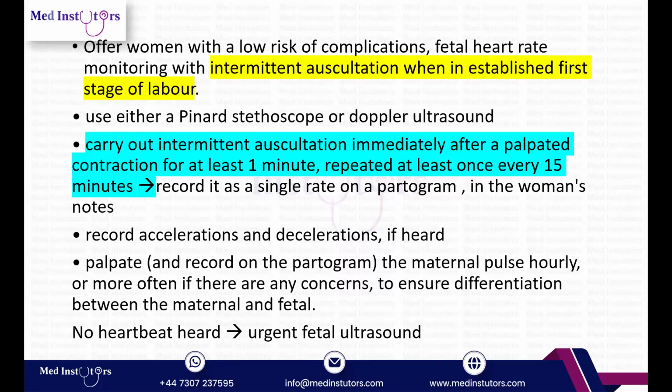Women who are low risk for complications, we would offer them intermittent auscultation in the established first stage of labor. How can we do that? You can use either a Pinard stethoscope or a Doppler ultrasound. You can carry out intermittent auscultation.